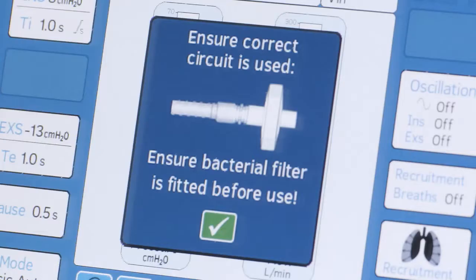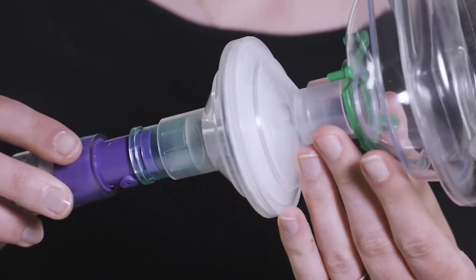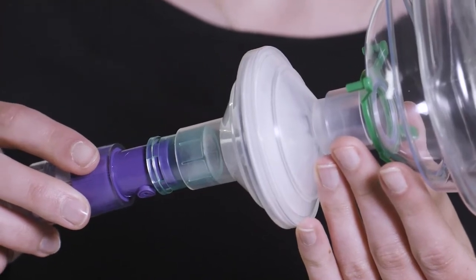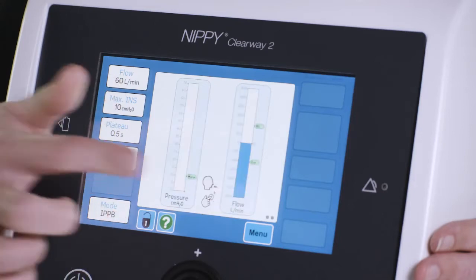A message will appear asking you to ensure the correct circuit type is used. A circuit with no leak should be used in an MIE mode. A circuit with a leak port should be used in the IPPB or NIV mode. Press the green box to confirm you are using the correct circuit type.